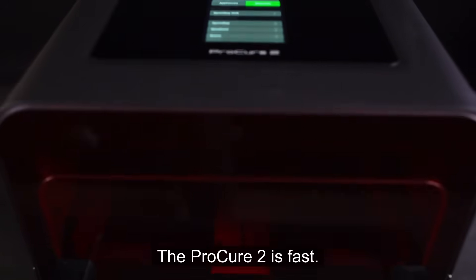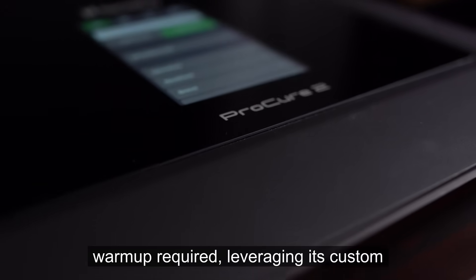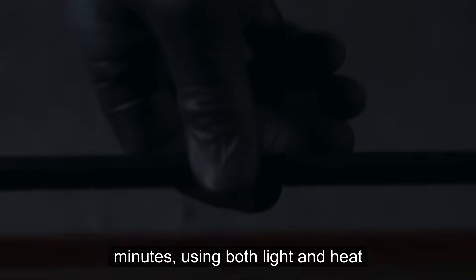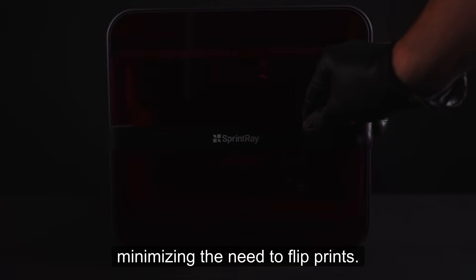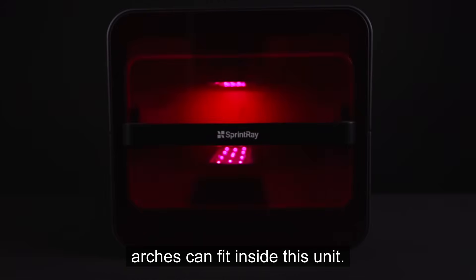The Pro Cure 2 is fast — fast enough to enable true single-visit chair-side workflows. Powered by its custom light unit, it delivers heat instantaneously with no warm-up required. Leveraging its custom wishbone curing engine, the Pro Cure 2 completely post-cures 3D printed crowns and guards in just a few minutes, using both light and heat for optimal mechanical properties. 385 nanometers of light is emitted from dual-carriage LED bulbs, ensuring 360 degrees of cure and minimizing the need to flip prints. Unparalleled capacity means 20 full arches can fit inside this unit.